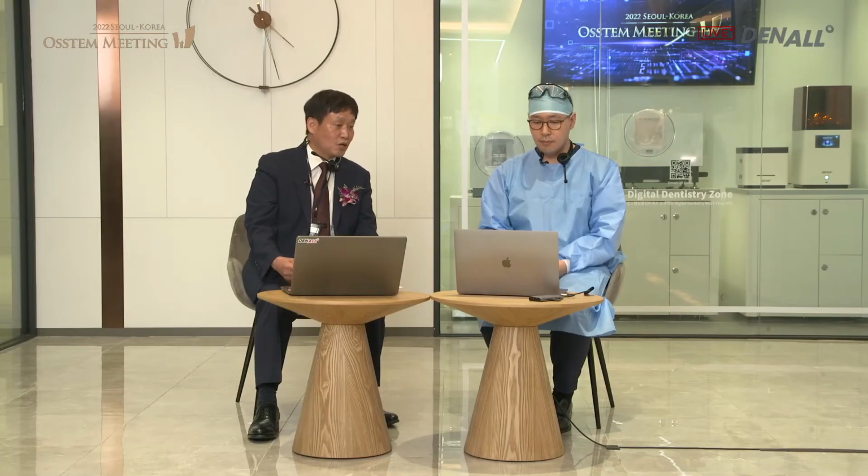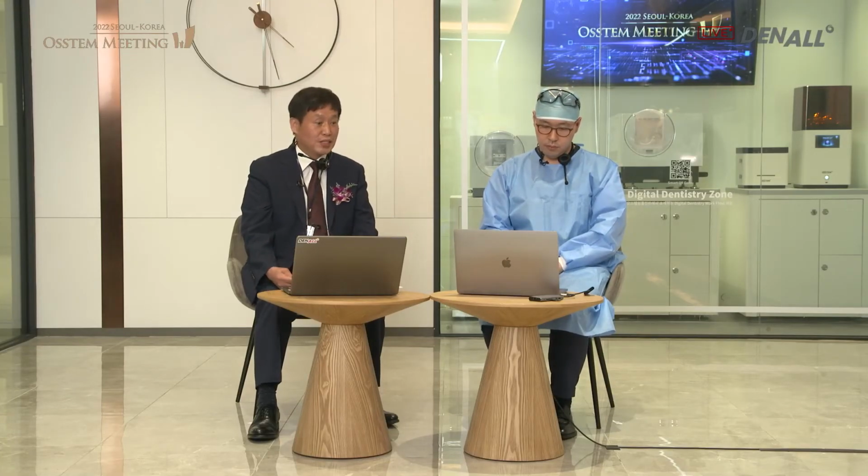So in the process, if the gap is too big and if the patient wants lip support, a full denture for the maxilla and fixed all-on-4 in the mandible would be appropriate. So lip support and cleansability can be enabled. So that should be considered during the diagnostic phase.